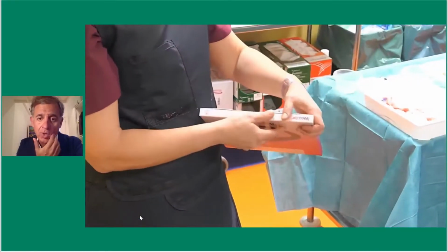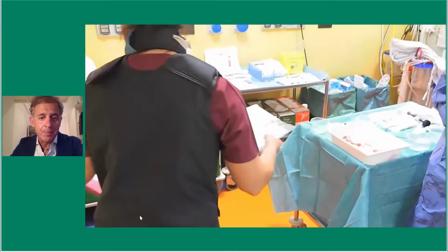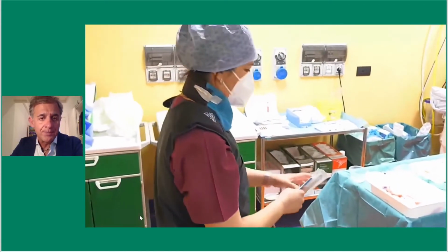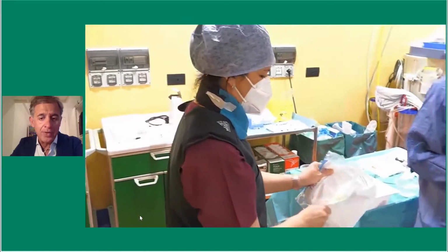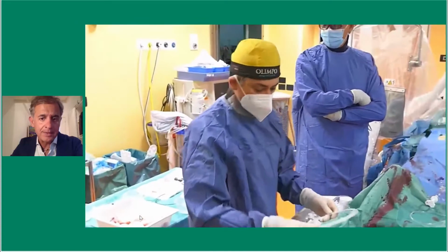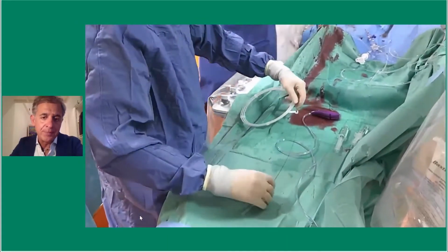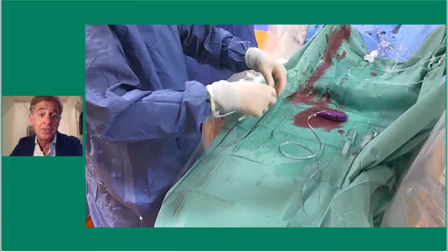And then we have an occlusion of the mid of the vessel. We start with the Navition microcatheter 135. For us, this was a good test because of the diffuse disease of the vessel and the calcification.